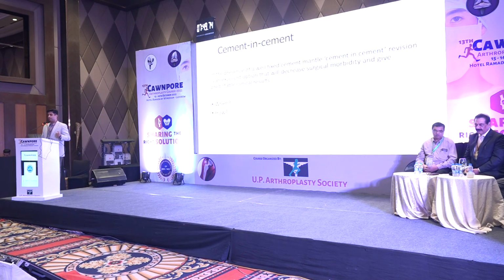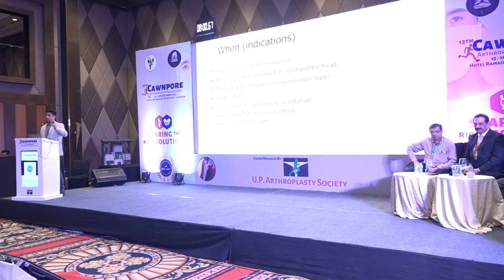For cement in cement revision, if you're thinking that the cement mantle is really well done, then it's a good idea to actually leave it, especially in aseptic scenarios. So you want to maintain that cement mantle, but actually it's only possible if you have put a larger size cement prosthesis earlier and you can manage to put a smaller size cement prosthesis. So if you're starting off with a big size 3 and you want to end up putting a size 1 or a size 2, you could do that. So you can just manage to burr out the cement.